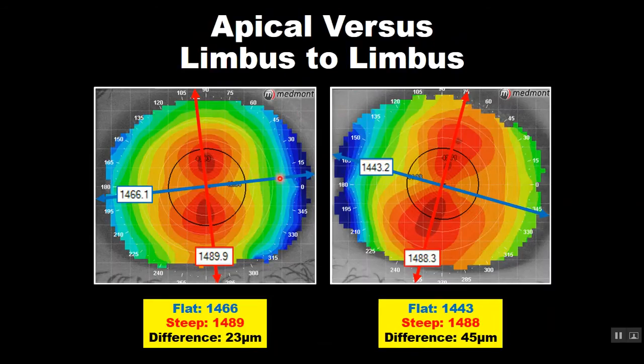Our apical astigmatism has a less toric peripheral cornea. This patient here, a much more toric peripheral cornea. This one would work much better in a symmetric Ortho-K. This patient will most likely require some kind of toric landing to create better fit, better comfort, and better hydraulic force and effect.